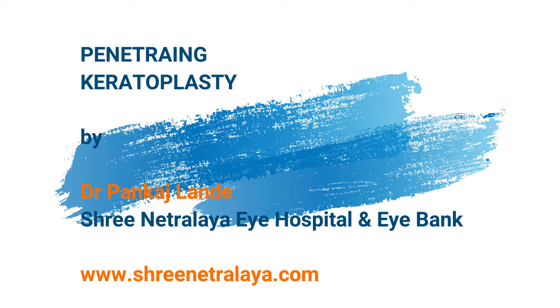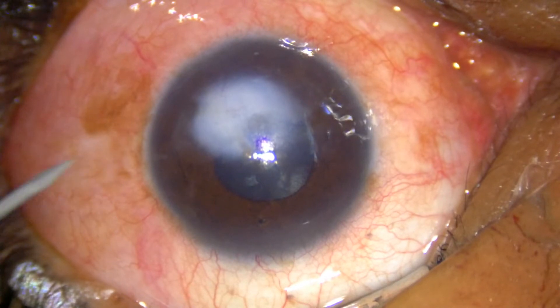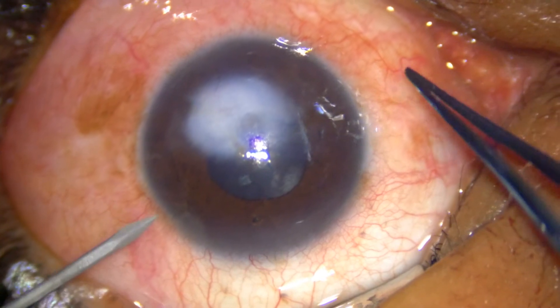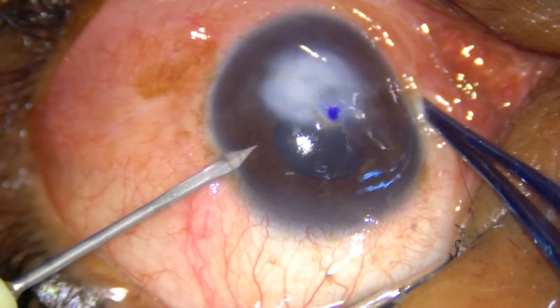Hi guys, this is Dr. Pankaj from Srinitra Land. I am going to do one case today which is a penetrating keratoplasty following a post-infectious keratitis. I am planning a full thickness keratoplasty in this case.